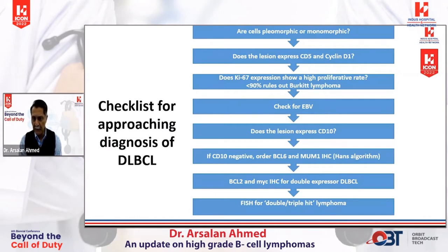So quickly going by, before I go into CD10, once again, it has to be pleomorphic or monomorphic. In monomorphic, I have to check CD5 and cyclin D1. If CD5 and cyclin D1 are positive, then I have to think of mantle cell lymphoma, blastoid or pleomorphic variant. If the Ki-67 is more than 90%, I have to think of Burkitt's. If it's EBV positive, I have to think of EBV positive diffuse large B-cell lymphoma.